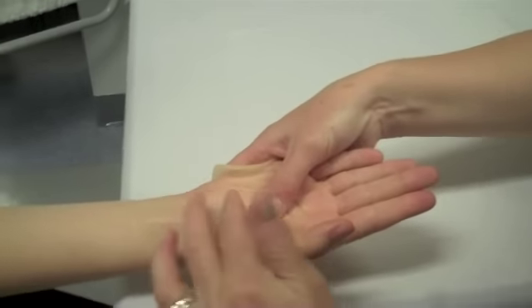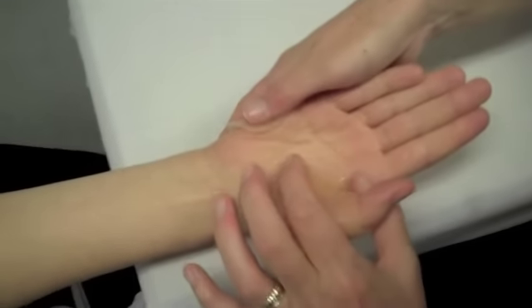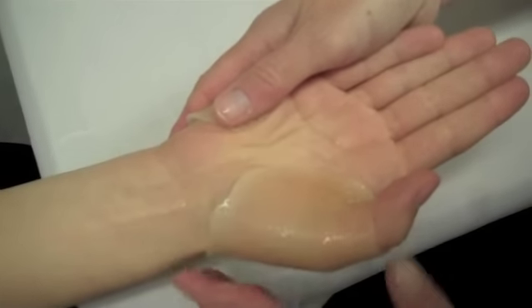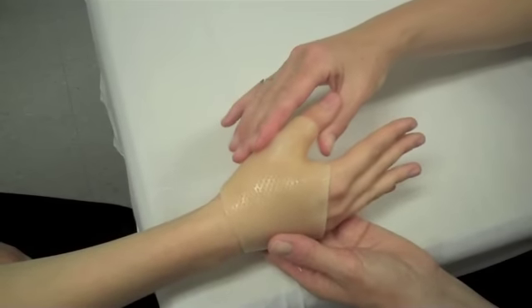Allow the material to sit on the patient's hand so that the material sets. This is especially important because ORFIT has a high degree of memory. This means that the splint material will need to be held in position longer, as it may shrink and not fit the patient if removed before the material has set.